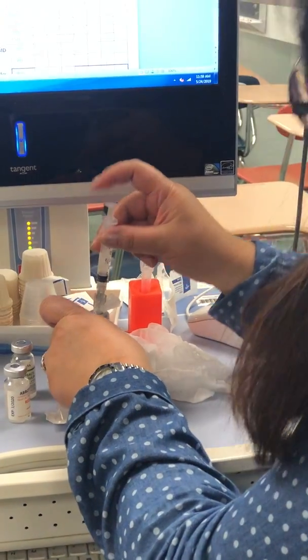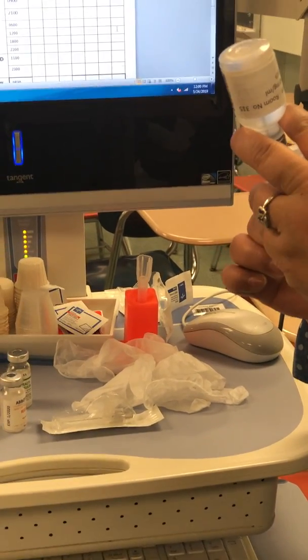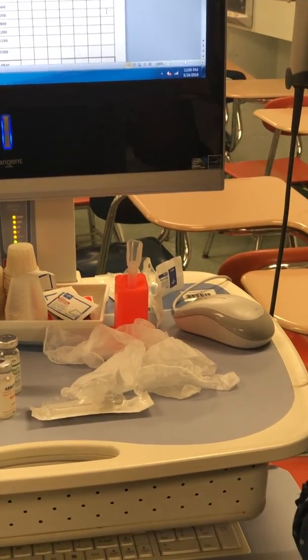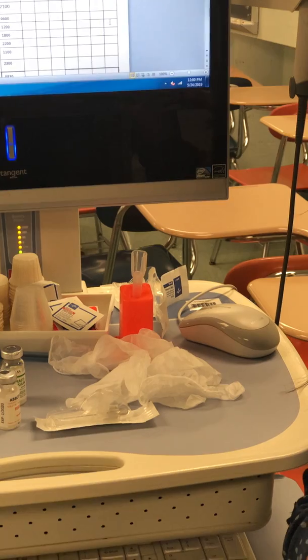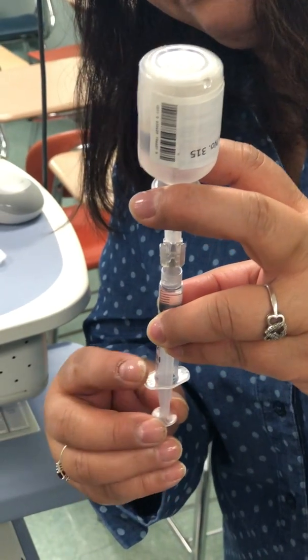Okay, so we put the air in, and we're gonna make sure that the needle is below the level of the medicine, and don't touch the plunger, right? Everybody, you have to practice because yesterday somebody was practicing and over and over she keeps on forgetting that she's touching over here.